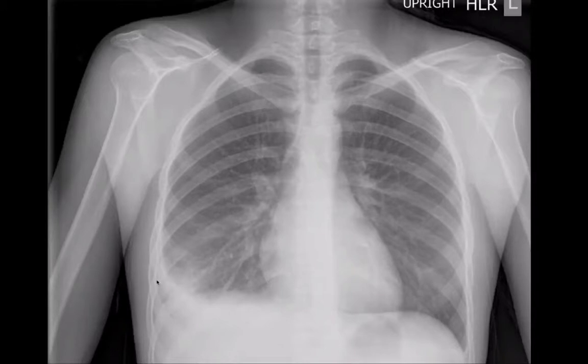And ultrasound is great, but it's not the one and only imaging modality. You've probably had lectures, and you might need other imaging modalities. So does she need... the only way that I can truly diagnose a pulmonary embolism is to do a CAT scan of her chest with IV contrast. And that's a lot of radiation for a 19-year-old, because there's always a risk of cancer down the line.